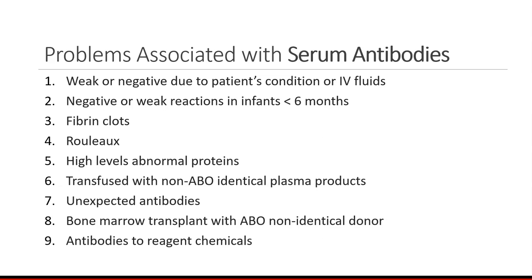After looking at hundreds of thousands of red top samples, you know what serum looks like. It is some shade of yellow. If you get something that looks like water, then you have to ask for a recollect. Otherwise, you could be putting the patient's life in danger.